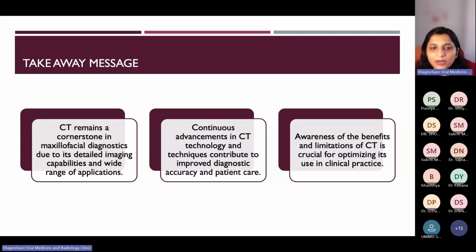So whenever you advise CT, make sure you advise it when it is essential. You follow all the protocols. See when the CT is needed, when MRI is needed, or when it can be done with ultrasound or other 2D imaging.